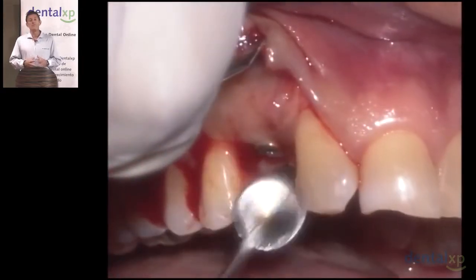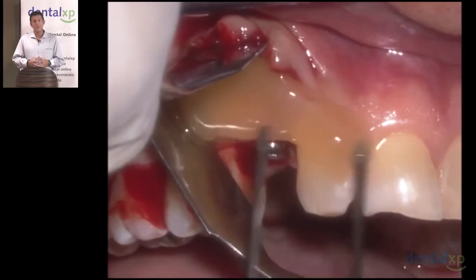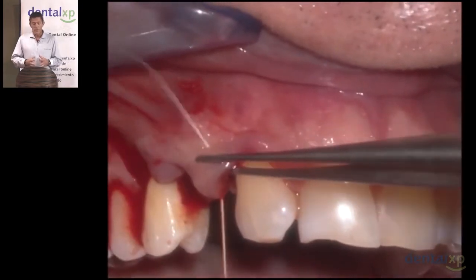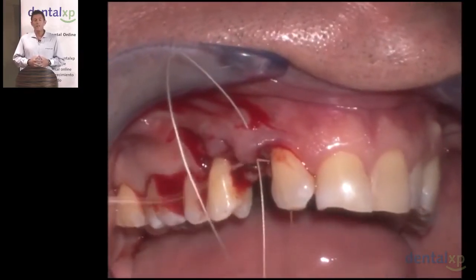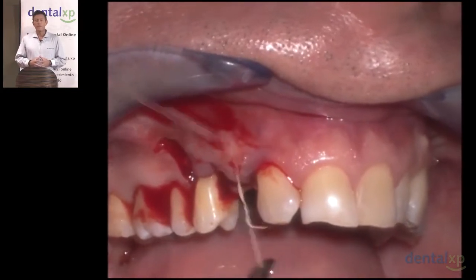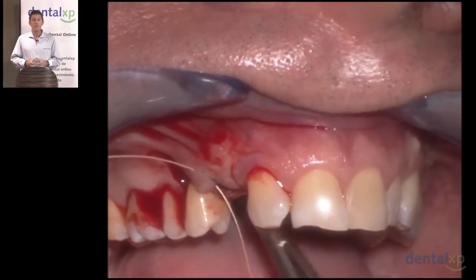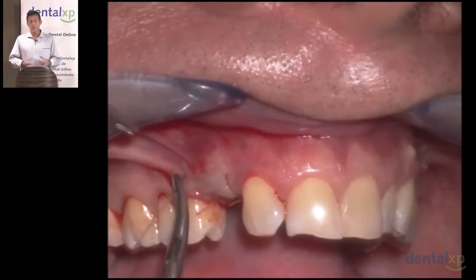We're then going to utilize multiple layers of fibrin as an autologous membrane that is impregnated with the growth factors from the patient's own blood. This is mixed with vascular endothelial growth factors, or VEGF, as well as plasma-derived and platelet-derived growth factors. Only then will we suture and close utilizing a Gore-Tex or polytetrafluoroethylene PTFE suture, 5-0, and we're going to use interrupted plain sutures. What we're attempting to do is utilize a healing abutment at the time of suturing. This will allow us to maintain a transmucosal connection to the body of the implant so that a temporary restoration can be facilitated within 72 hours.